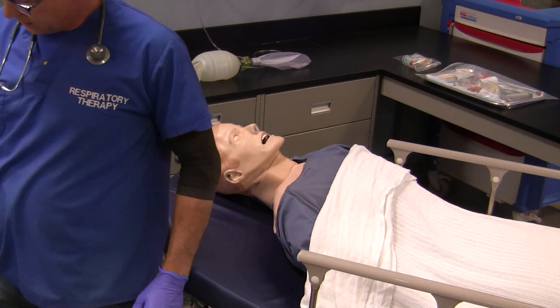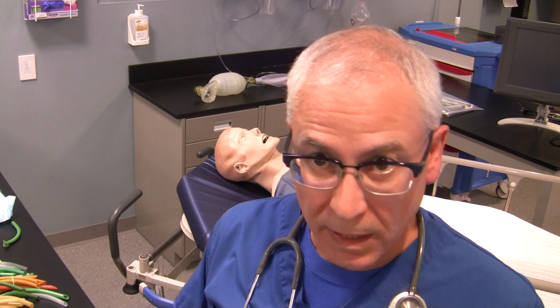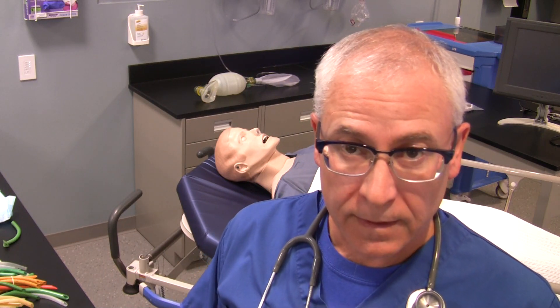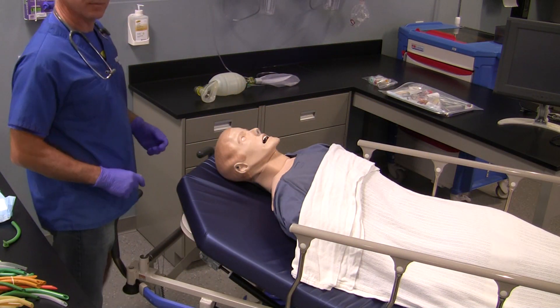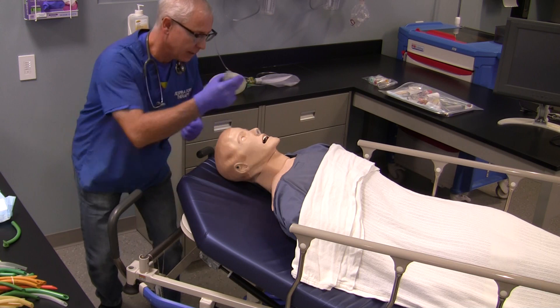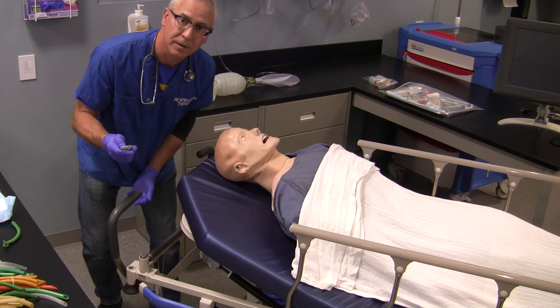If the patient wasn't breathing, then obviously I'd have to do something else — grab the manual resuscitator and start ventilating the patient with the appropriate amount of volume at the appropriate FiO2. To recap: we put a nasopharyngeal airway into our patient, sized it for length and diameter, and after placing the device we assessed placement to ensure the patient was breathing from it. We could also, if needed, suction out the back of the patient's pharynx by placing a suction catheter down through the NPA and removing any secretions in that area.